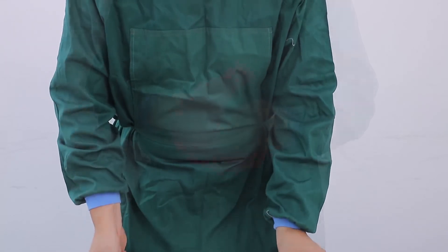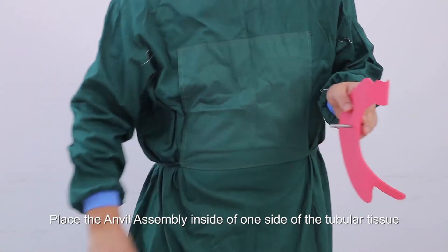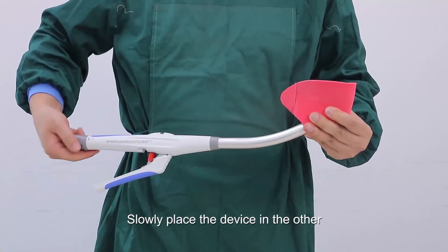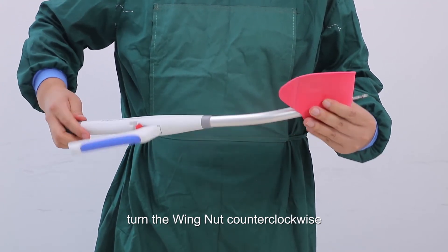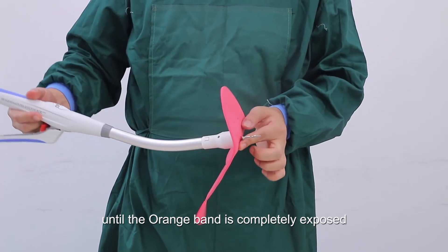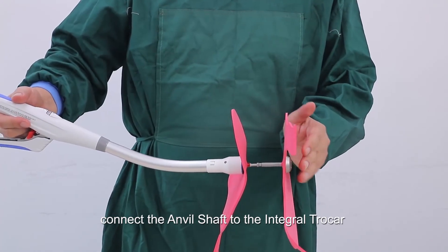Place the device aside. Place the anvil assembly inside one side of the tubular tissue to be anastomosed and make a purse-string suture. Slowly place the device into the other side of the tissue. Turn the wing nut counter-clockwise, extending the integrated trocar until the orange band is completely exposed, then connect the anvil shaft to the integrated trocar.